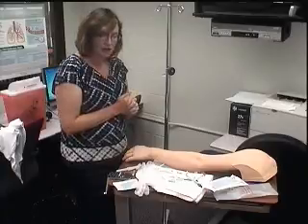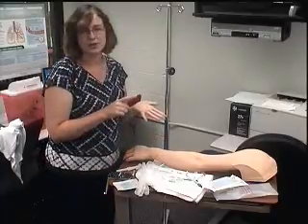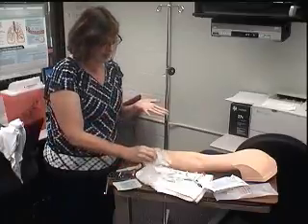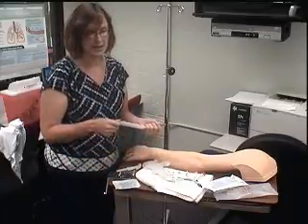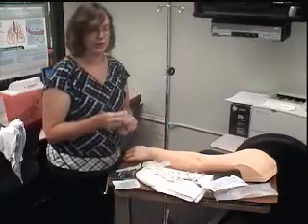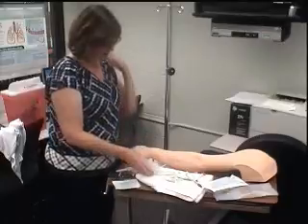All right, so allergies, making sure they're not allergic to tape, to any kind of latex, any of that kind of stuff. Or, of course, the fluids, if they're not allergic to it. Let's say I'm hanging Rocephin, and they're allergic to it. So if I'm hanging some kind of antibiotic or something like that, making sure.